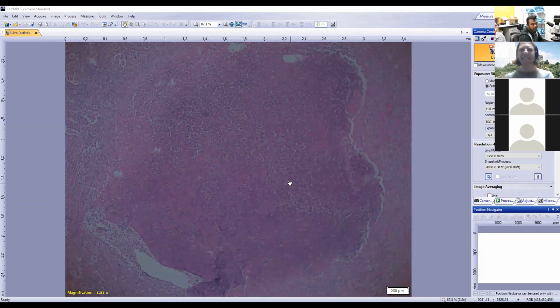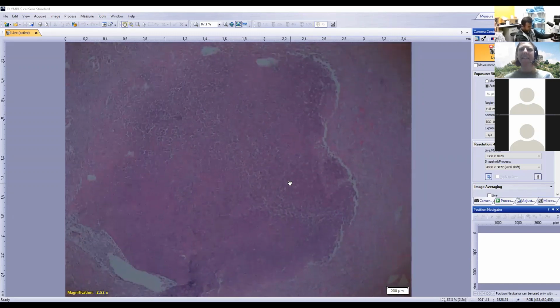So I would say there's two processes going together. But yeah, cool. With the amount of lymphoid depletion and lymphadenitis you'd see in Rhodococcus, and also the amount of nodular changes in the lung, it would be much more severe, I would say. Yep. That would be if it was the primary cause. Yeah. Just that one focus we got here.